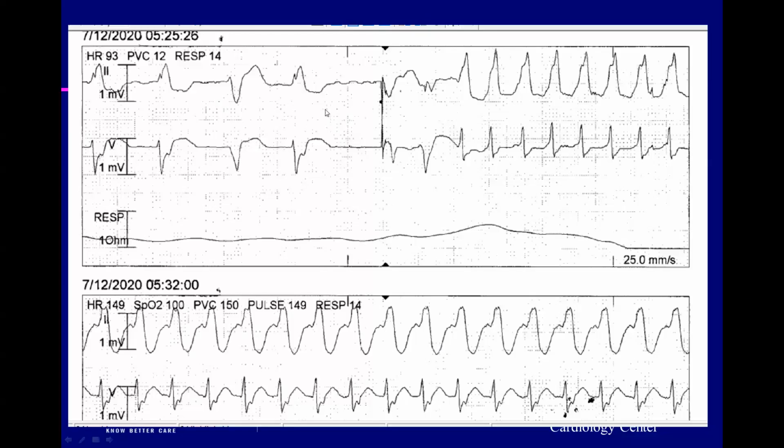Good. Dr. Schmitt, I have a question. So there is also an axis change, right? In tachycardia. Absolutely. Does it make any difference? Yeah, it makes a difference, because typically if you see an axis change like this, unless you have a really typical morphology in respect to right bundle or left bundle, this makes VT much more likely. Right. You're right. So this is a very different morphology here. And this is a criterion: a PVC here induces a very different morphology compared to these PVCs here. So, right. Yep. Thank you.